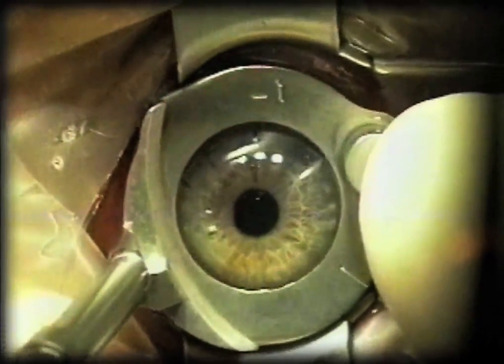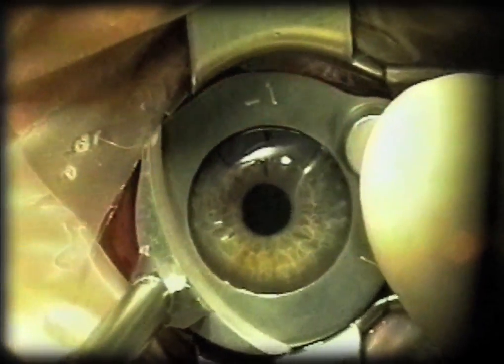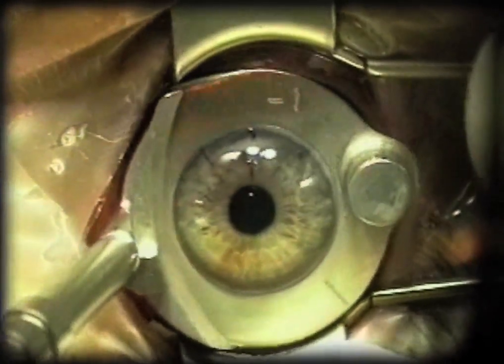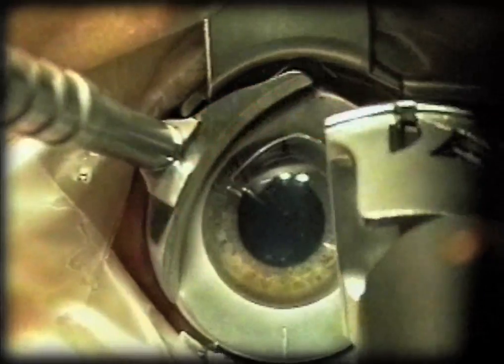In order to gain access to the orbit, I've rotated the ring counter-clockwise, and now I lift up and rotate it clockwise. You can see the curvature of the speculum blades matches the curvature of the suction ring. Because of the cutouts, you can slip in the head of the microkeratome without fear of catching lashes or skin. So we seat the microkeratome and advance it once again.